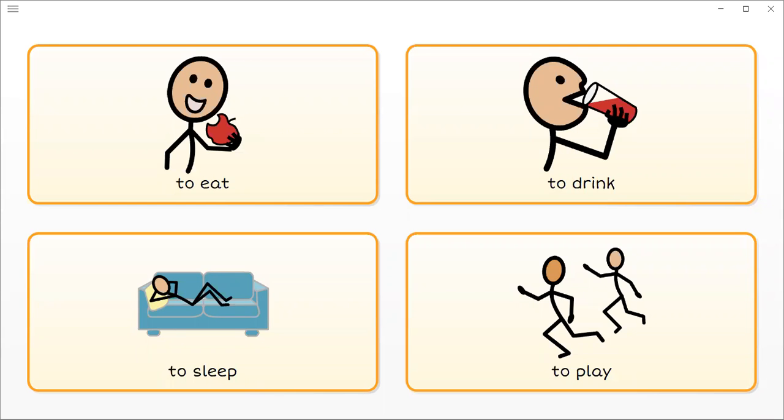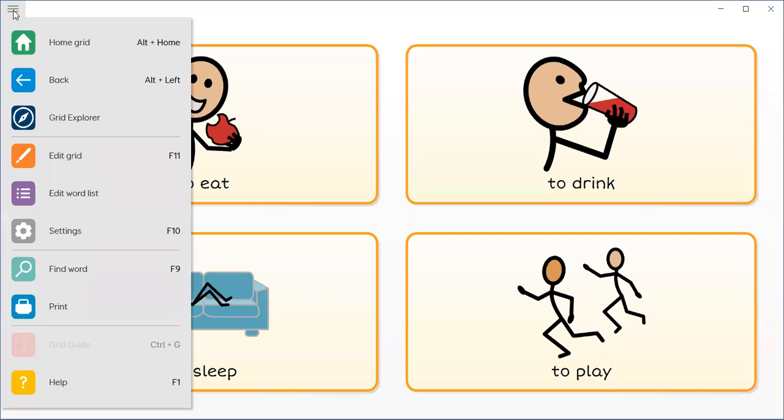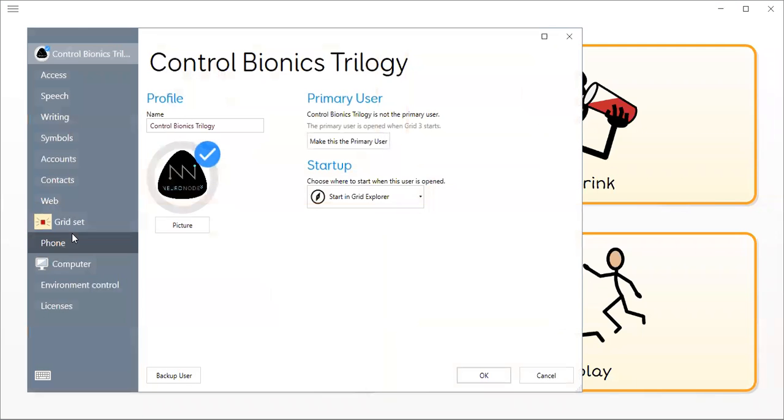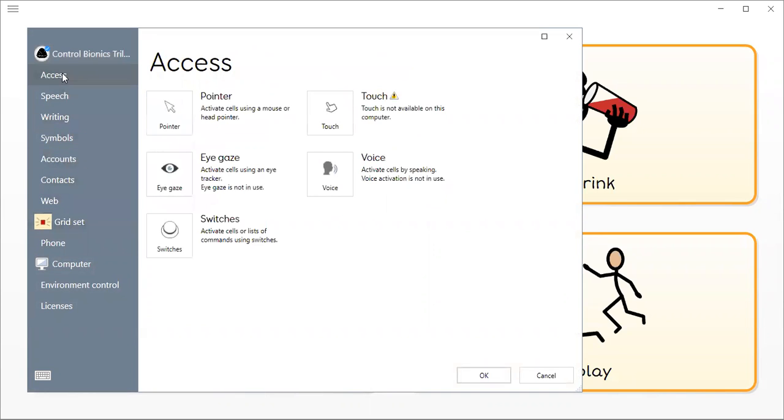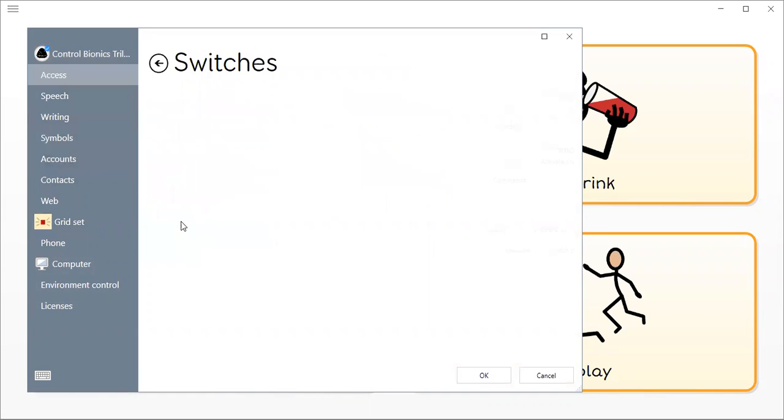How do I customize my scanning? I go into Menu, then Settings, then Access and Switches.